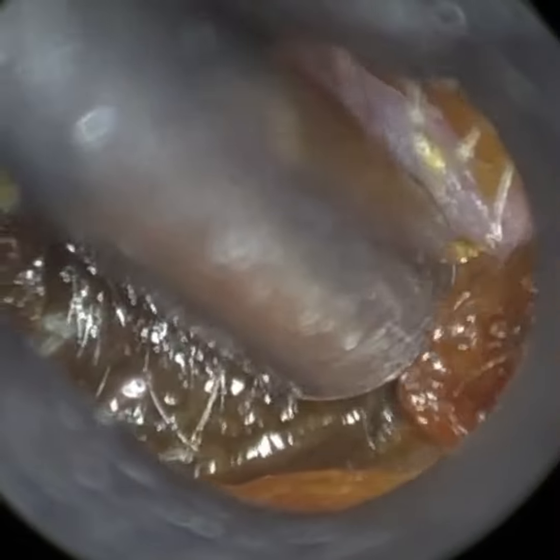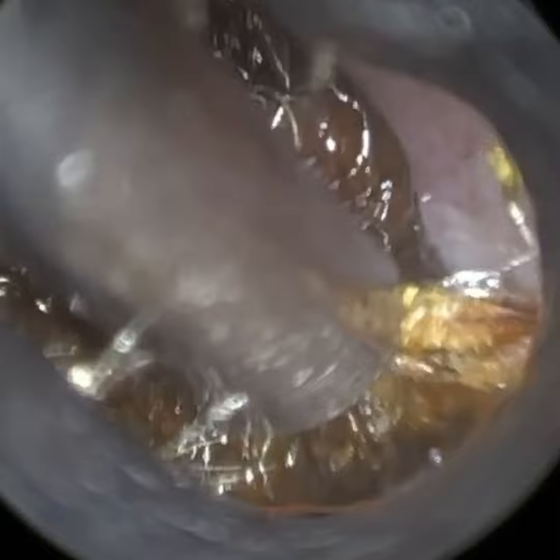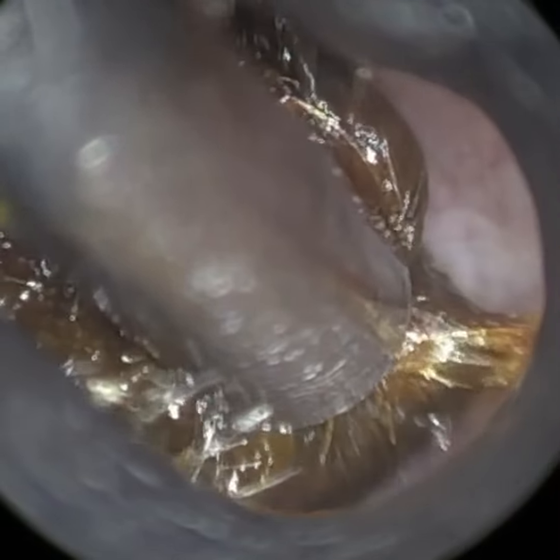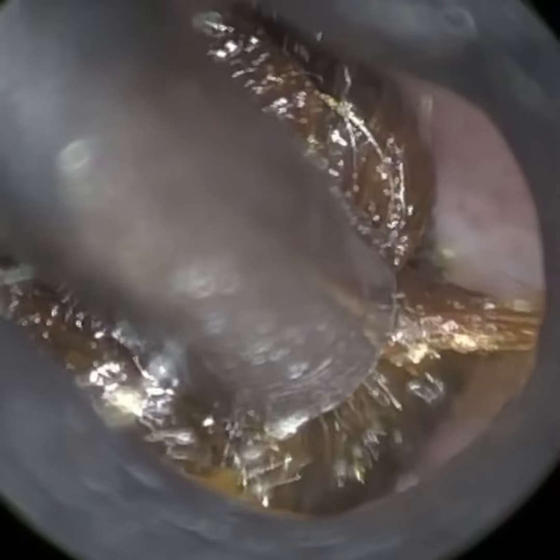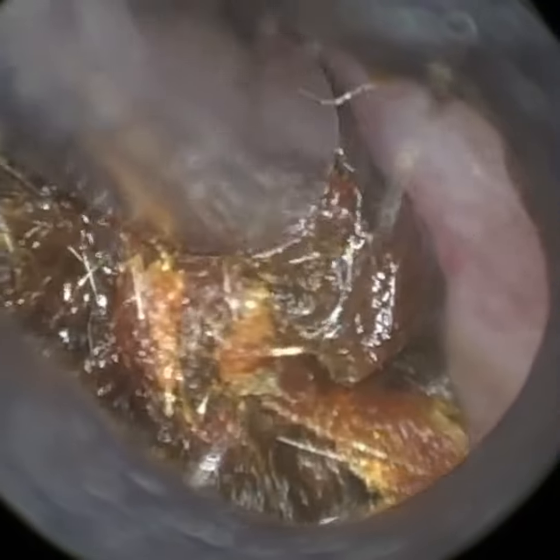I've just put some more oil here. I'm just at the base of the ear canal, just trying to lift. You can see this is dead skin, and this is the wax that I'm on now. Prior to that you can see there's a ribbon of dead skin just to the right of the suction probe.